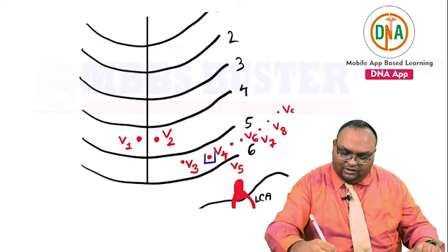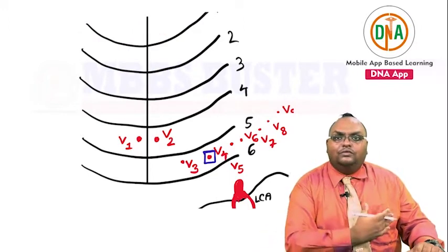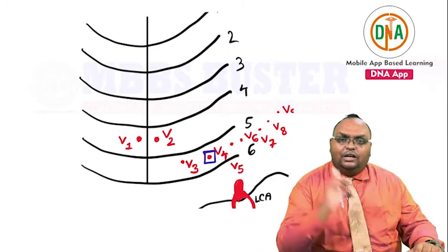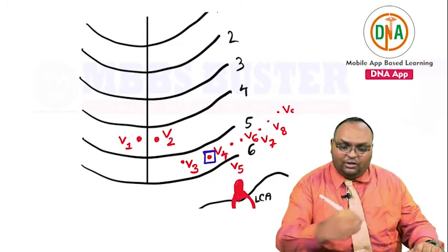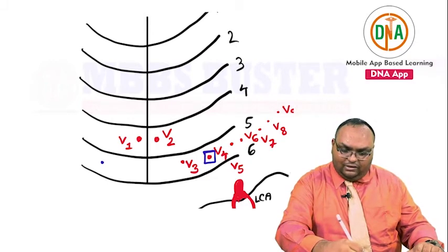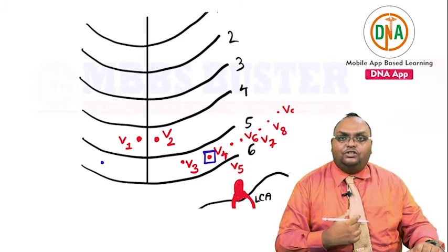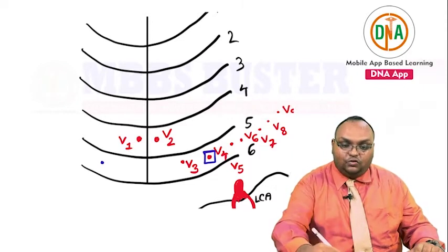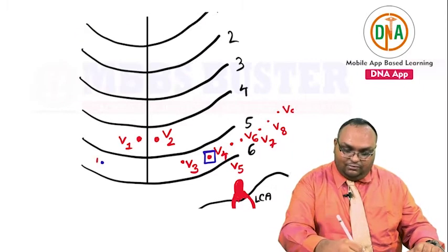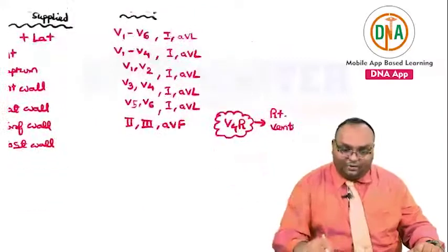That means you have the left fifth intercostal space, a lead placed at the left midclavicular line named V4, and in the right fifth intercostal space a lead placed in the right midclavicular line, which would be known as V4R, and that would look directly into the right ventricle, right?